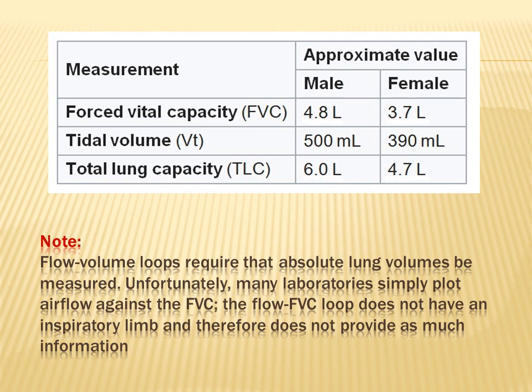What I would like you to know from this slide is that a proper spirogram should contain tables that show absolute lung volumes and the calculated parameters, not just figures, because figures alone cannot give you the proper idea about the diagnosis.